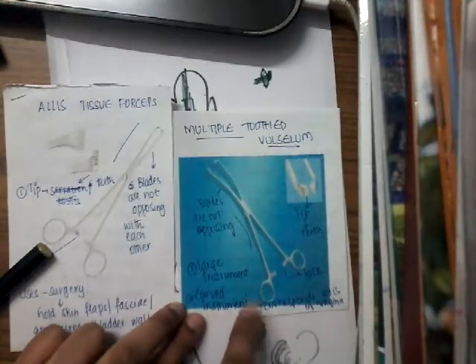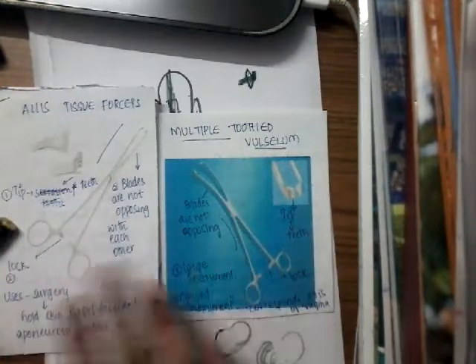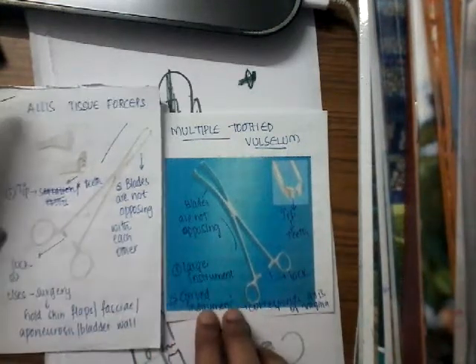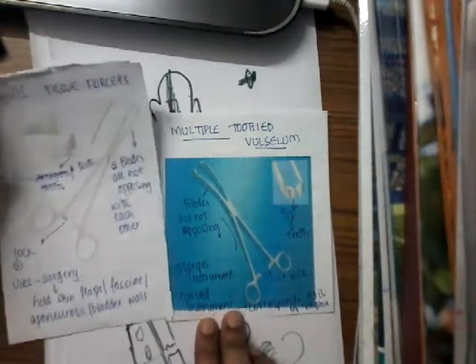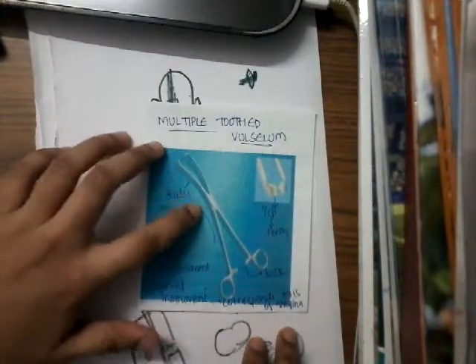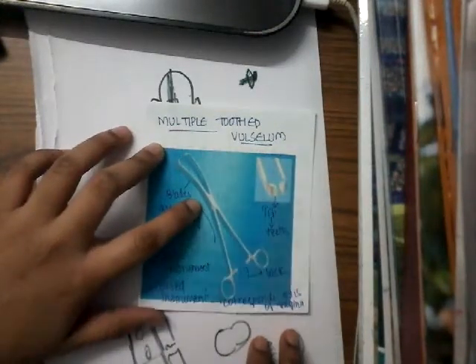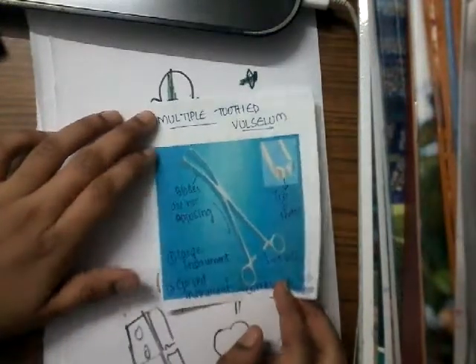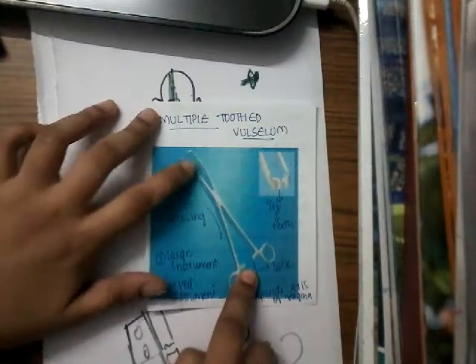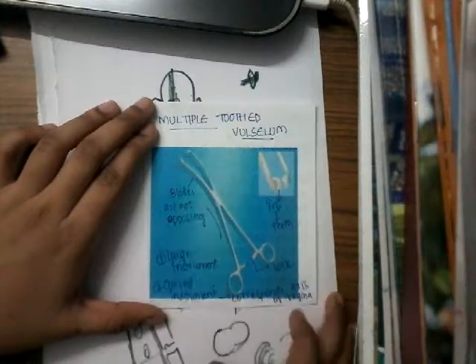The multiple tooth valsellum is a larger instrument compared to Alice forceps. Based on these two differences — the curve and the size — you'll have to differentiate between Alice forceps and multiple tooth valsellum. The curve of this instrument corresponds to the axis of the vagina; that is the reason why it is curved. So it has a lock, the blades are not opposing, the tip has teeth, and the instrument is curved to correspond to the axis of the vagina.